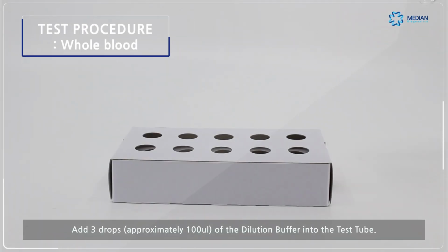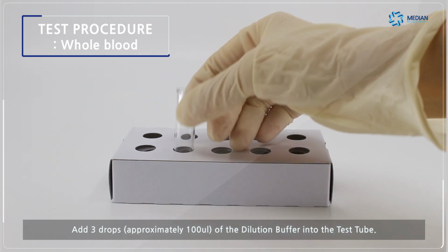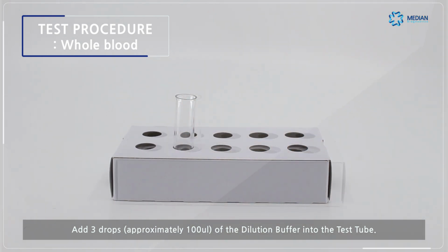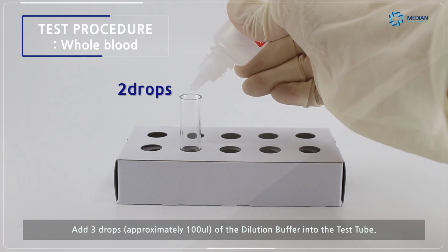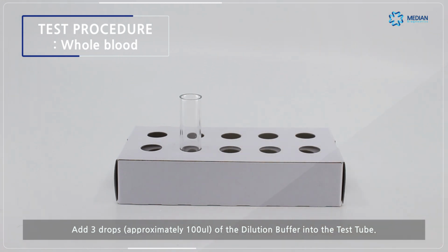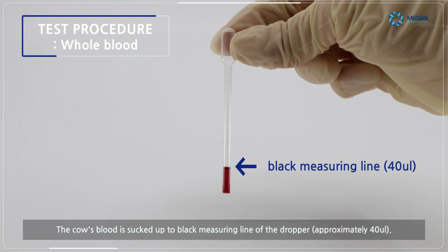If you are testing with whole blood, begin by adding 3 drops of dilution buffer into the test tube. Next, use the dropper to draw the cow's blood up to the black measuring line, which indicates 40 microliters.